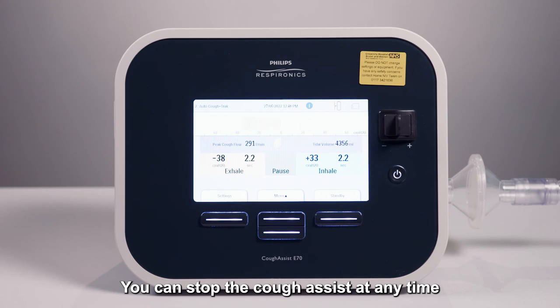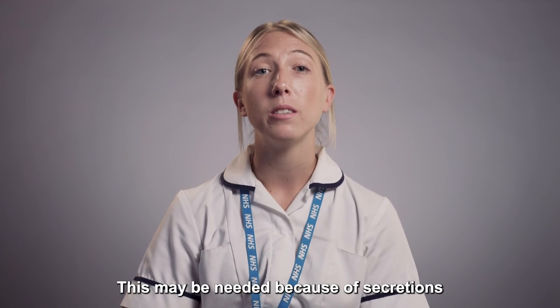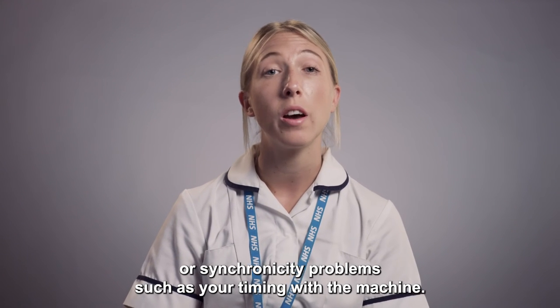You can stop the cough assist at any time by pressing the standby button. This may be needed because of secretions or synchronicity problems such as your timing with the machine.